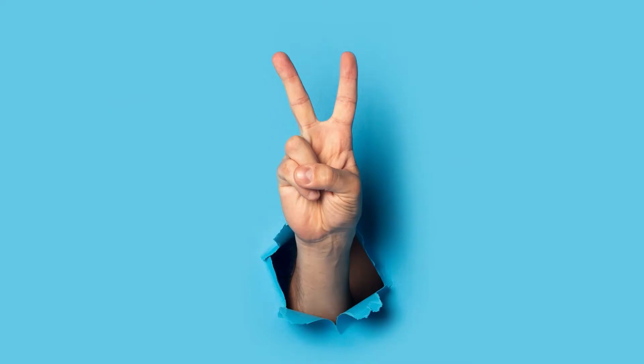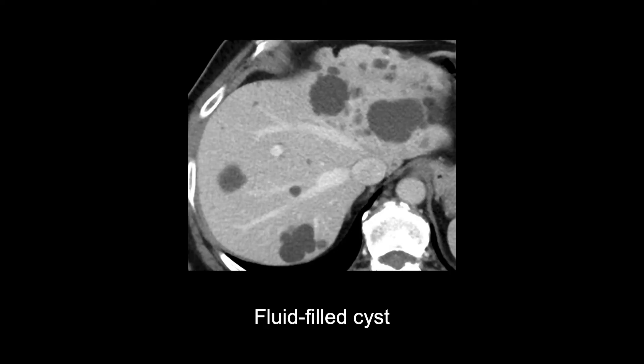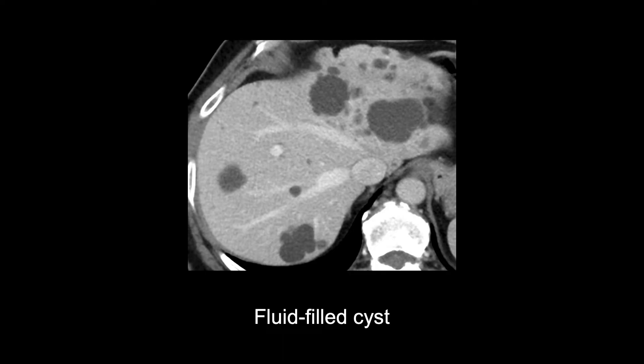When evaluating the liver for different types of masses, there are two common types of benign lesions to look for. The first is a fluid-filled cyst, which will appear darker than the surrounding liver tissue, with a smooth, thin, or imperceptible wall. Patients may have only a few or many cysts, as in this case.